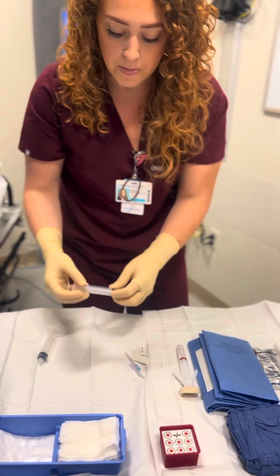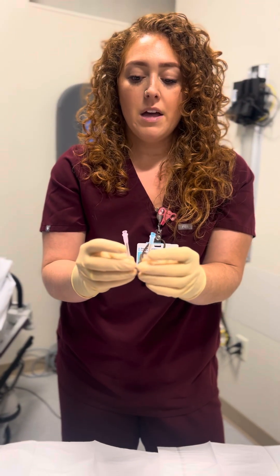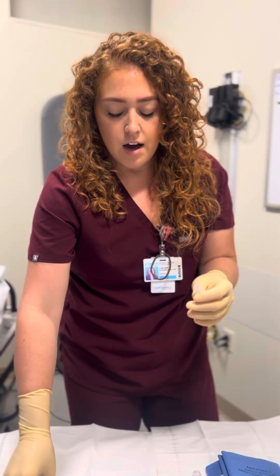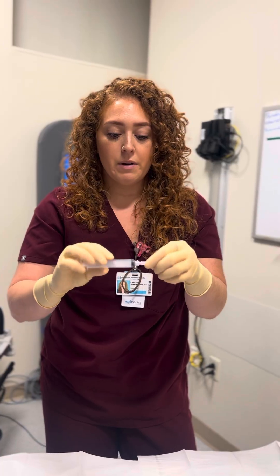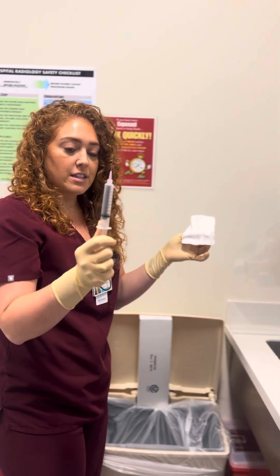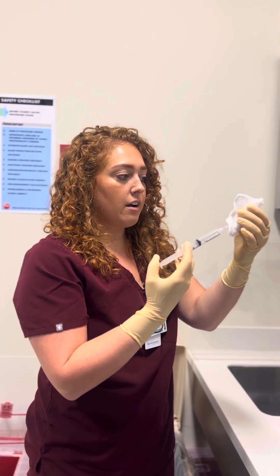Now I'm going to take my syringes and get them going — make sure they're limber. We have blue and pink needles: the pink is a thicker gauge and the blue is a smaller gauge. When drawing up medications and saline, use the thicker gauge needle because it's easier to draw up. I'm going to draw up my lidocaine first — always lidocaine first, saline second. I'll use my 10 cc syringe, attach my pink cap needle, uncap it, take a piece of gauze from the sterile tray, and insert it into the lidocaine bottle. Using the gauze I can touch the bottle and still remain sterile. I'm going to inject air and draw back the medication.